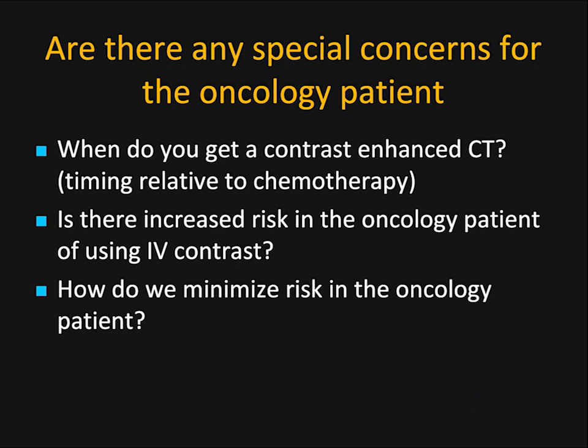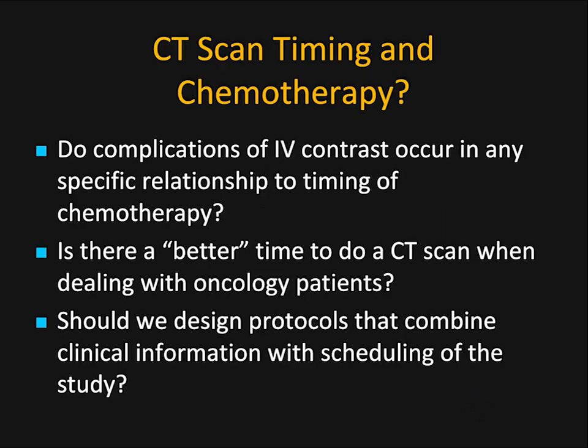So, questions maybe we don't think about. When do you do a contrast scan? Do you do it after chemotherapy or before chemotherapy? Do you wait 24 hours or does it make a difference, or do you need to wait 48 hours? Is there an increased risk in the oncology patient in general with IV contrast? And if so, how do we minimize the risk in the oncology patient? We talk about timing. Do complications of IV contrast occur in any specific relationship to this timing? We do many patients, and I'm sure you do as well. A patient comes to CT, gets a scan, then goes to the clinic and may get chemotherapy in the afternoon.